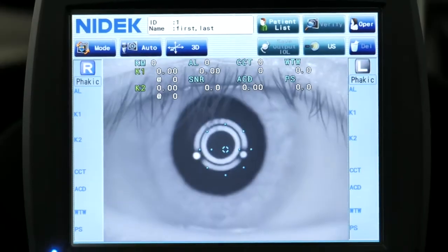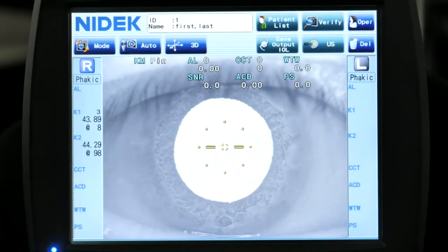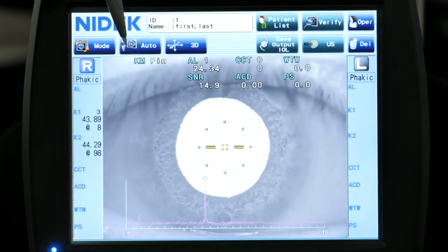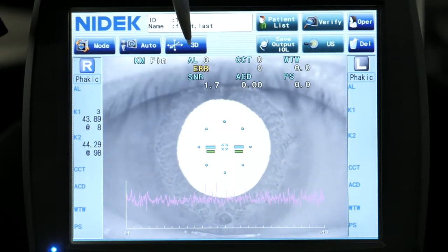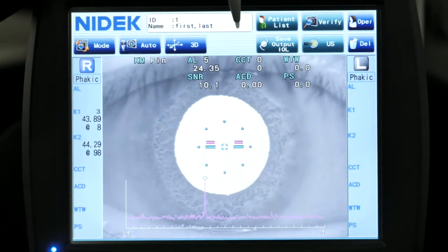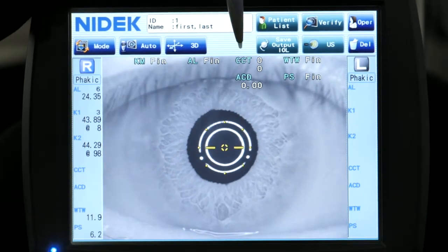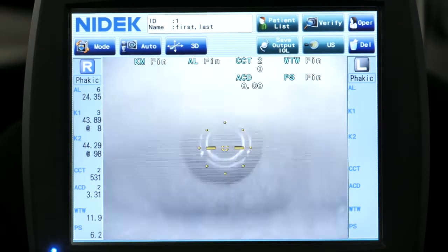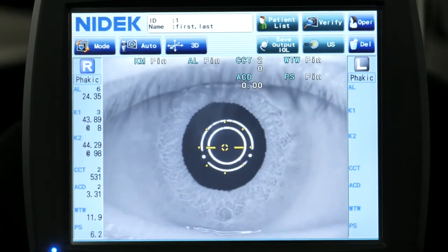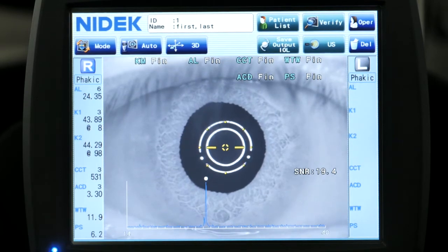So you just essentially align this up to the patient's pupil, move the device in, it takes over. It's given us the K measurements already, it's given us our axial length measurements, then it's going to move over and get you central corneal thickness, anterior chamber depth, white to white, and pupil size. And as you can see, the exam is already completed — that's how easy it is to use.